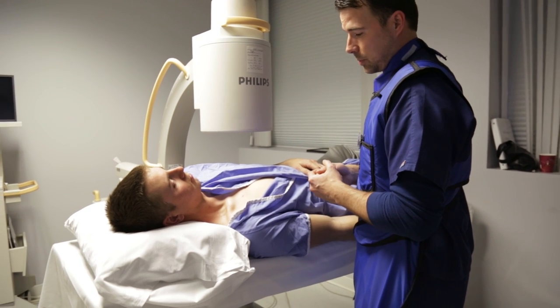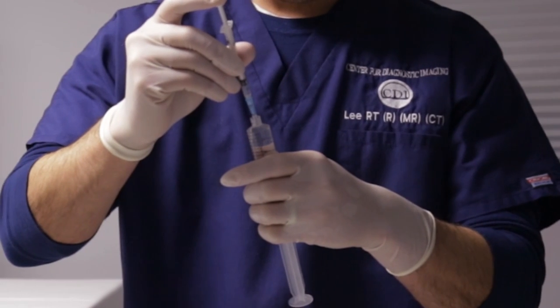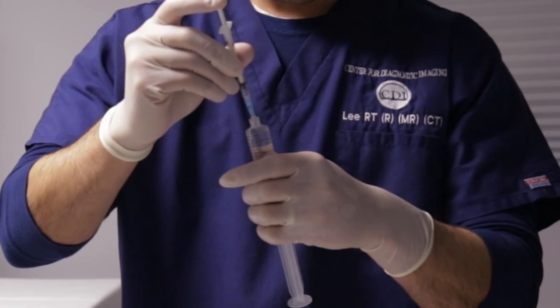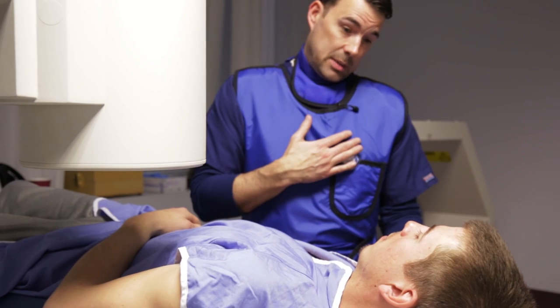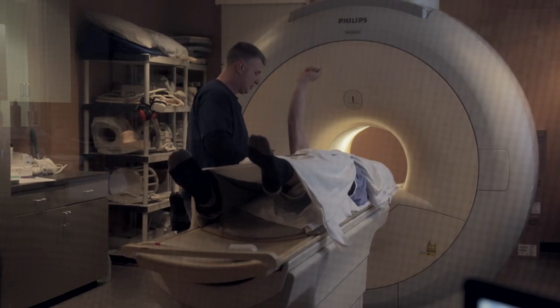It burns a little bit. The procedure involves using needles to inject fluid into the joint, usually a hip, shoulder, wrist, elbow, or knee. The main concern is people don't like needle procedures. So we reassure them that one, it's very fast; two, we use local anesthesia; and three, it's actually a very thin needle that doesn't hurt as much as they would think. We really can relax the patient — it's all in the technique and how you talk to them. You take your time with them and you get most of those patients through.